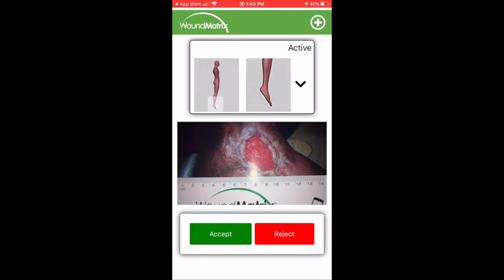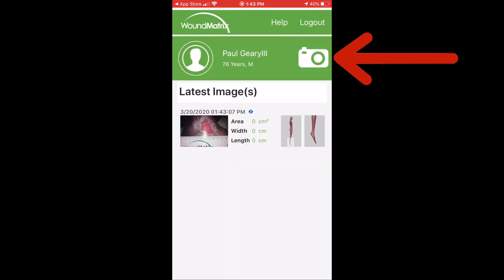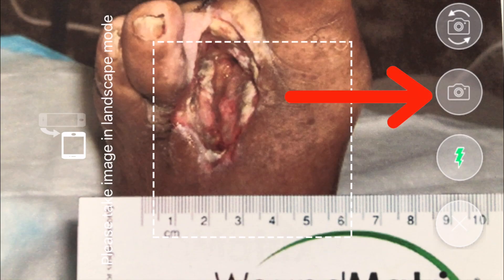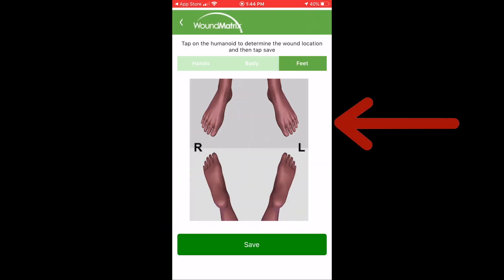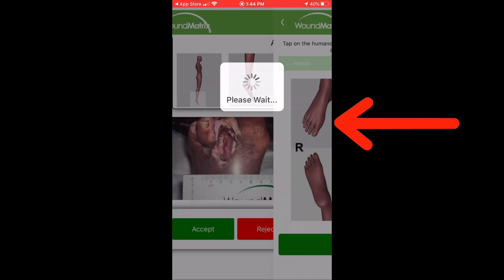If you have a second wound, tap the camera icon again. Take your picture and tap Accept. Then create a new wound location.